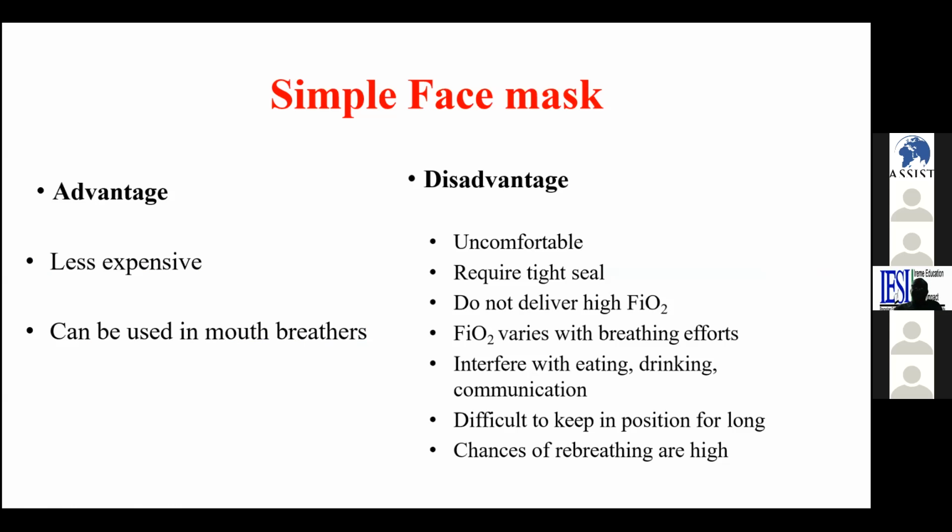Of course, it's less expensive, and it can be used in mouth breathers, especially patients who develop an obstructed nose, maybe from upper respiratory tract infections. This is very helpful. As a disadvantage, it can be uncomfortable. It requires a tight seal, so make sure you are covering the patient's nose and mouth.